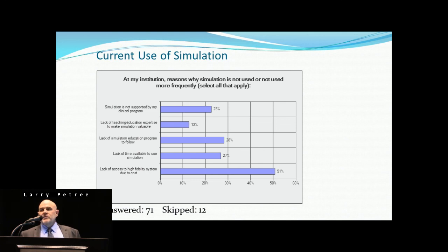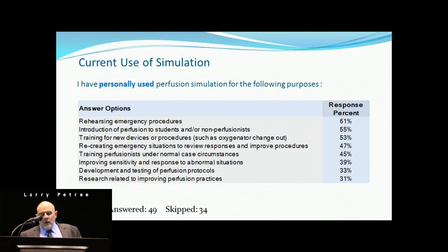So again, I think there's some gaps and some opportunities for us to fill. In terms of personal experience with simulation, the question was, I've personally used perfusion simulation for the following purposes. The highest rank was rehearsing emergency procedures. That's probably not a surprise. Hopefully most of you practice an emergency procedure like an oxygenator changeout in a simulated situation on a somewhat regular basis, or you've at least tried it and gone through your protocols.